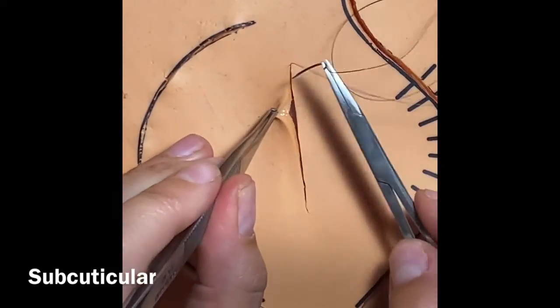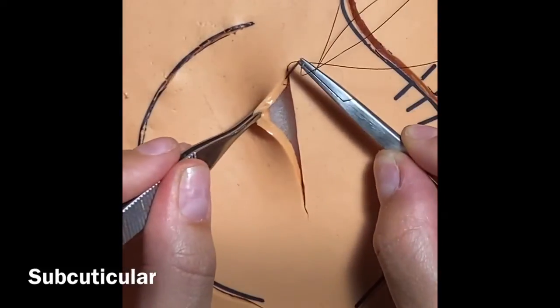I'm right-handed, so I like to start on the left side. Evert the skin up, go in at that dermal epidermal junction, and you're going to move in the direction of the skin, just like that.